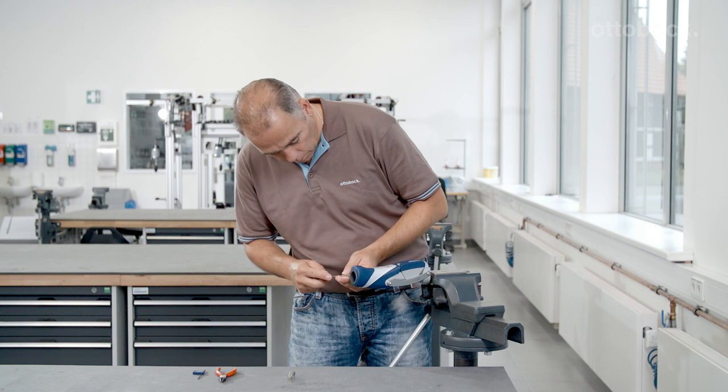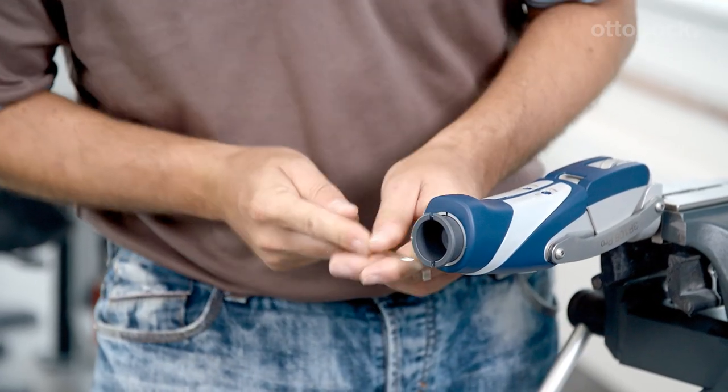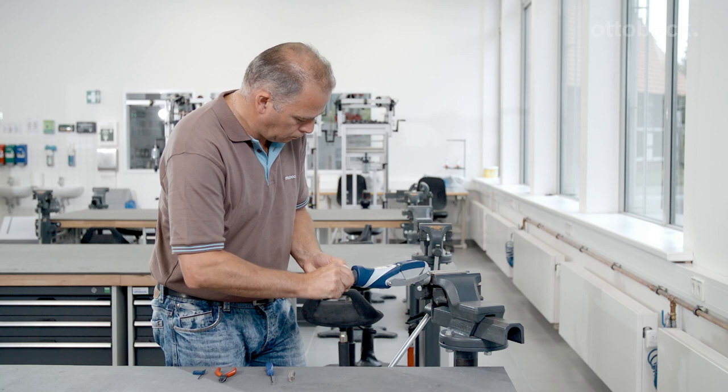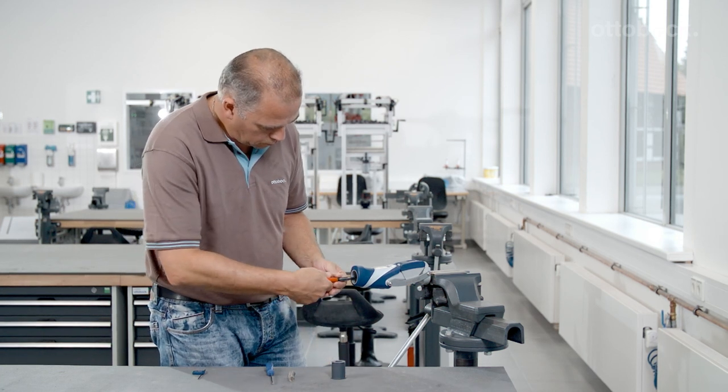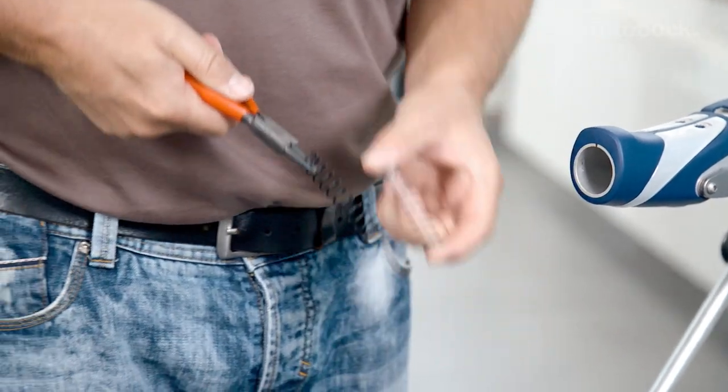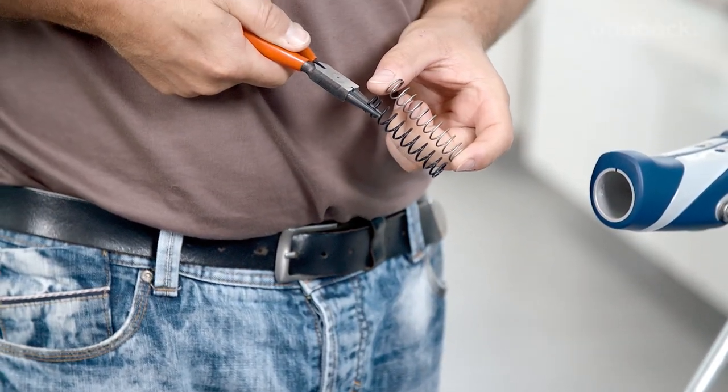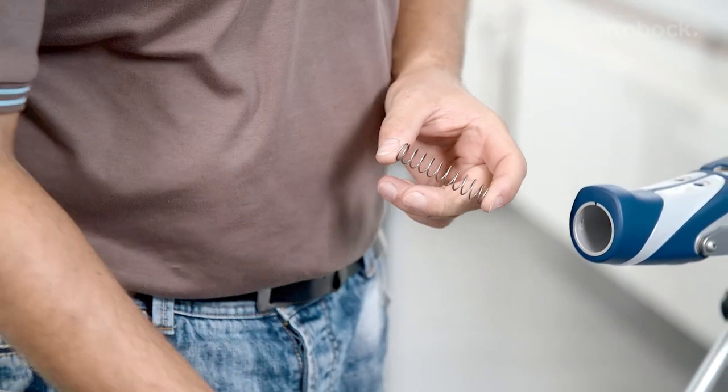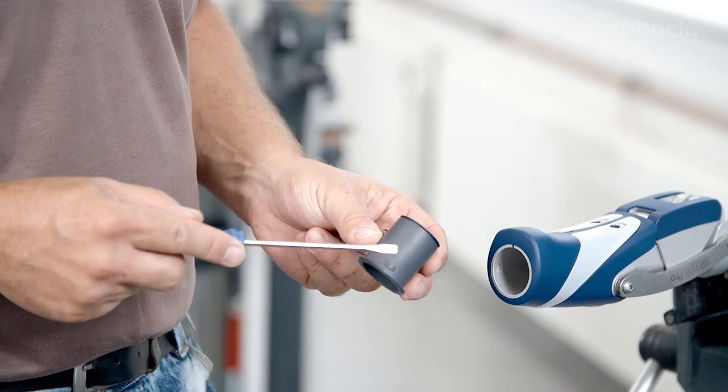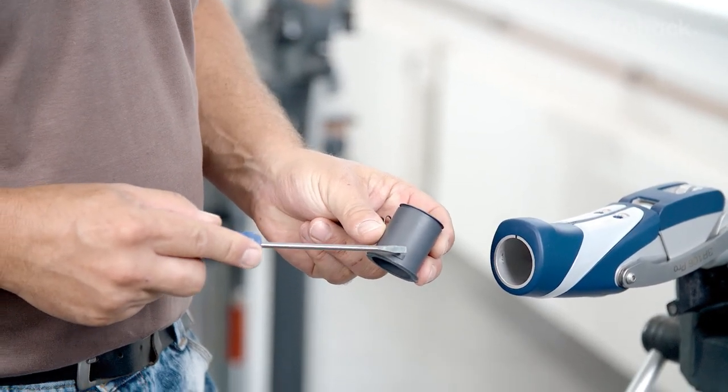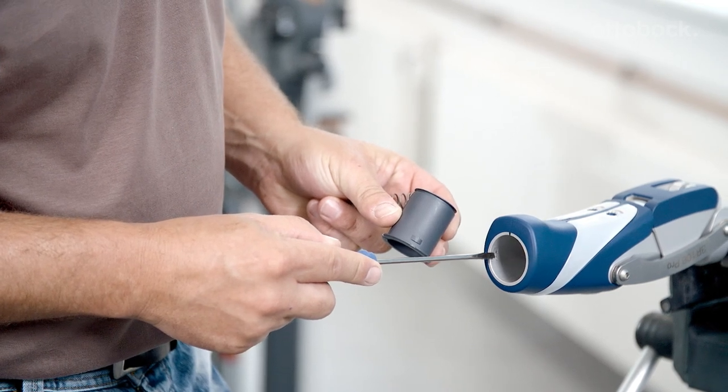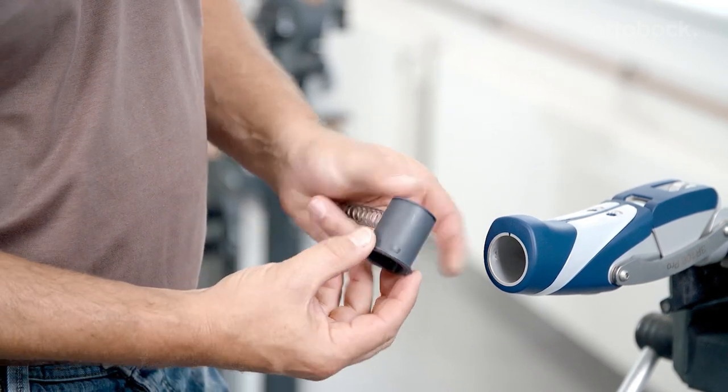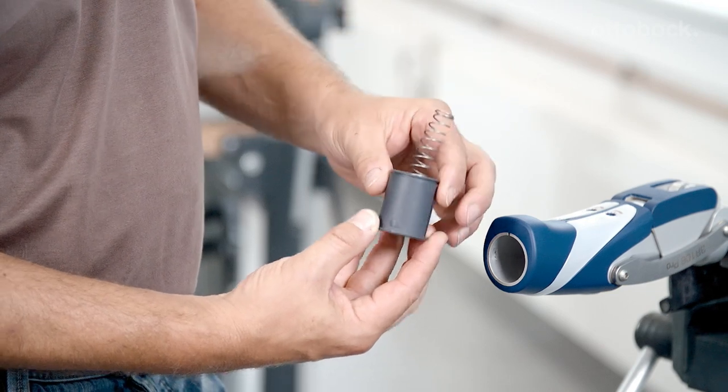The integrated extension assist spring is part of the swing phase control mechanism and ensures extension of the prosthetic knee joint. If required, the installed strong compression spring can be replaced with the weak compression spring or omitted entirely. To prevent injuries due to falling, this is only permitted if the patient is able to bring the prosthetic knee joint to full extension prior to heel strike in all situations.